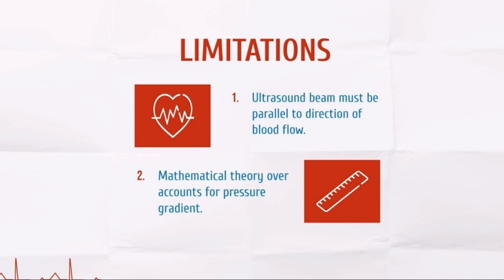However, because of the advanced mathematical theory underlying this technique, we can assume that anything within 20 degrees difference from parallel to the direction of blood flow has a small enough effect on the calculated velocity that it can be ignored.